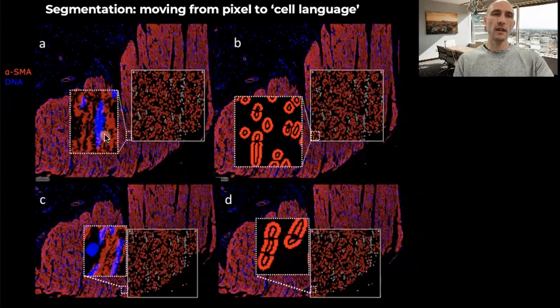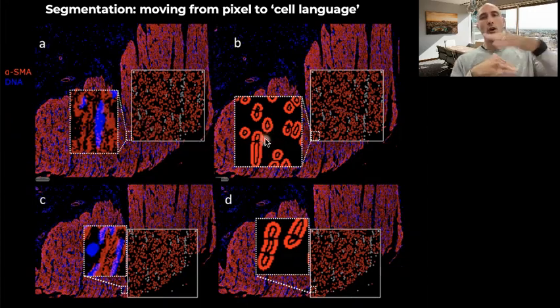As you can see here in A, we have what looks like a single cell. Then we took exactly the same tissue stained with H&E, put it under the microscope, and checked that actually this was not one cell, but two cells. We ran the same region of interest in Hyperion, and then put the image in our software. And as you can see here, our software did a decent job identifying that this was not one cell, but two cells overlapping each other.